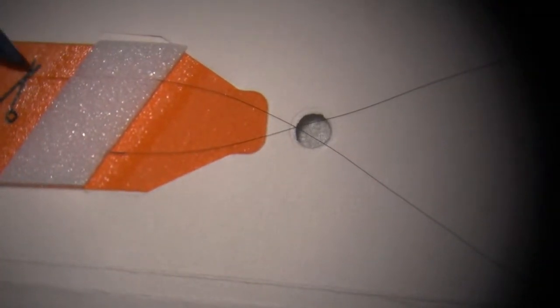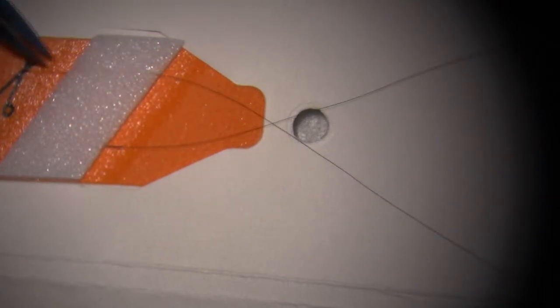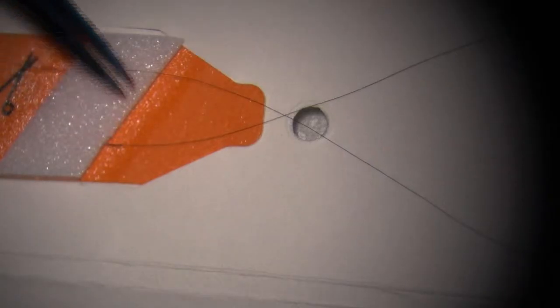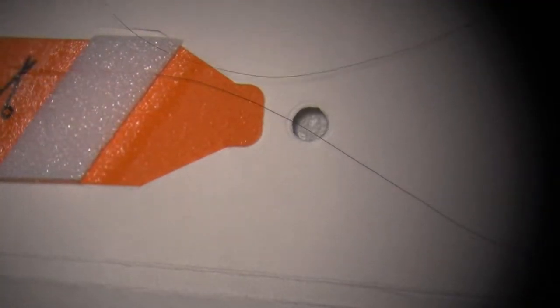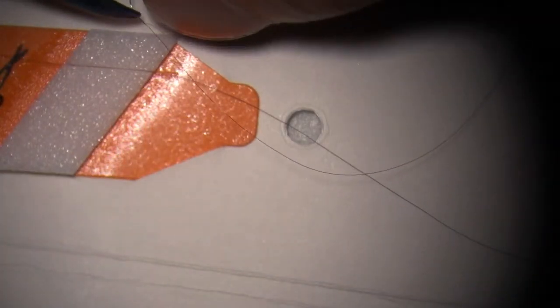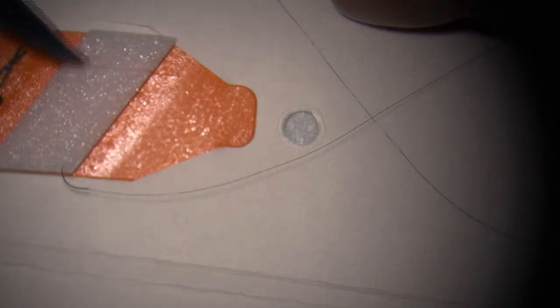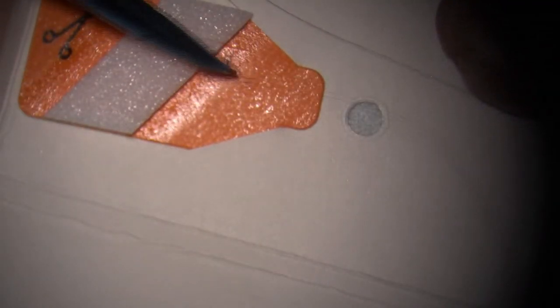So to take the needle out, you see here is a scissor. Usually they would like to cut here. Some of the suture, this Ethicon suture is good. The sponge is not, the suture usually won't start in the sponge very firm. Some of the suture starts deep into the sponge. If you try to take the needle out by pulling it out, sometimes it starts there very bad, and then we pull the suture and the suture will break from the needle. So we usually would like to release the tail first when there's nothing stuck in the sponge, and then we take the needle like that. Got it. And I think they drew a scissor here to tell us to just cut it. Cut there, yeah. And dangling the needle. That's the way.